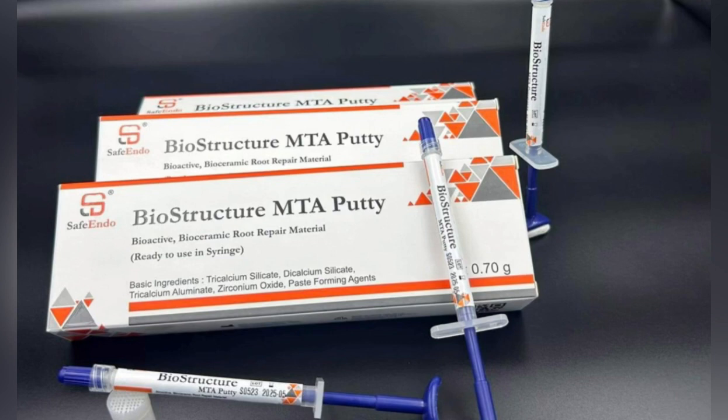Coming to its handling, this material is non-sticky in nature, so it can be easily taken from the syringe with the help of Buchanan pluggers or any other carrier, and it can be easily placed into the respective canal morphologies, in sealing of perforation defects or in apical resorption conditions. This material can even set in the presence of a little moisture. So it can be used in different clinical scenarios, as it is a bioactive material.